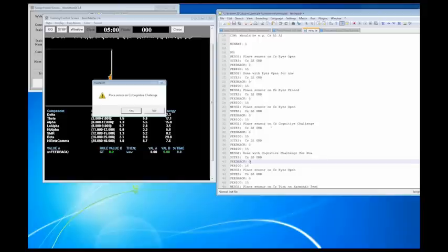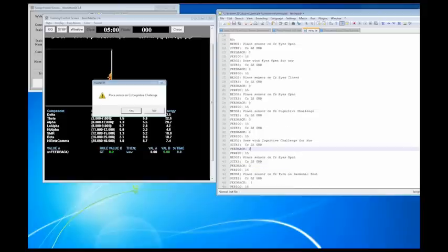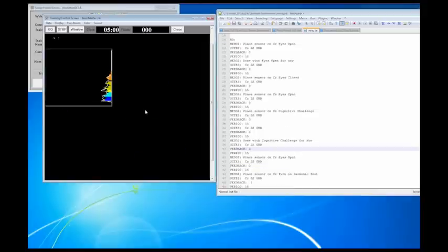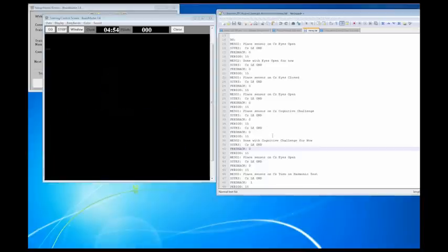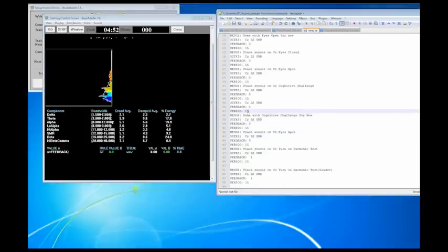All right, we are right now on our place sensors as the cognitive challenge. We're going to be doing this for another 30 seconds. And actually another 45 seconds because this is a message 2, which means it's going to be after this session right here.